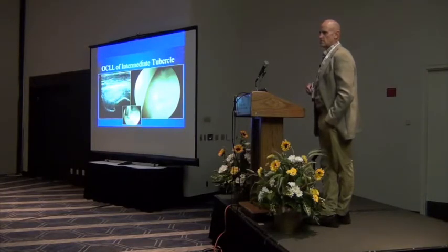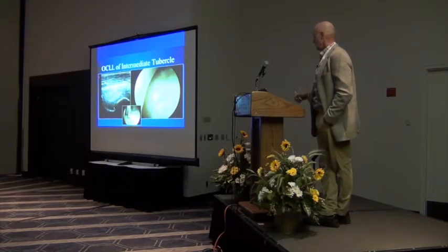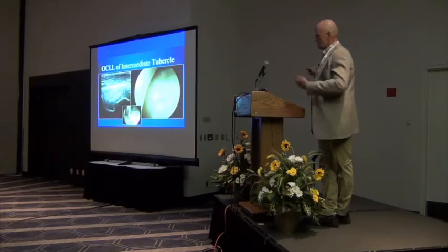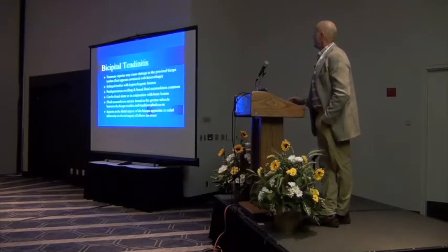And it's just like treatments for medial condyles. We have a tendency to want to get into these and just inject the synovial lining with some steroids. And this horse went back, and the biceps tendon is pretty stiff, so we actually used a cannula to kind of move the biceps out of the way and then drove the needle through the middle of the cannula to get down into the cyst.